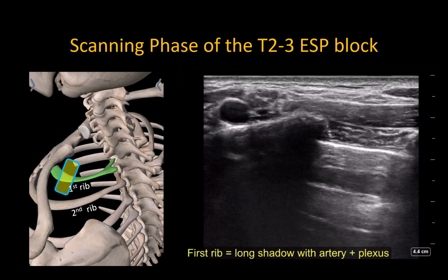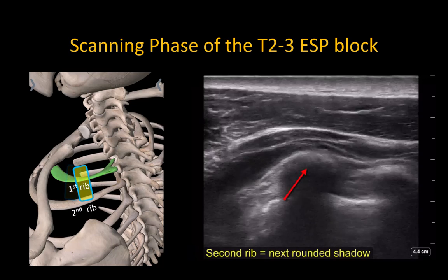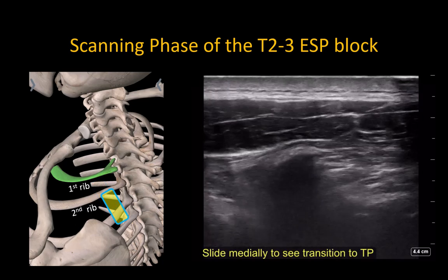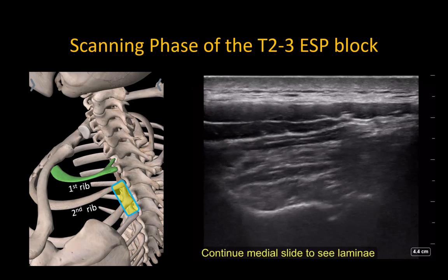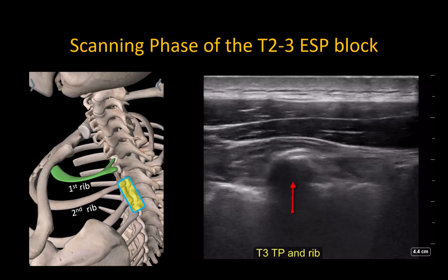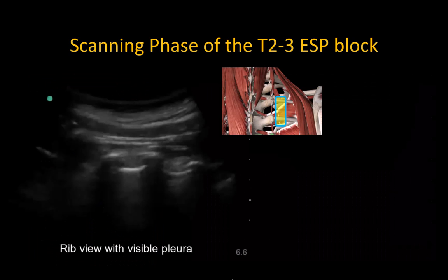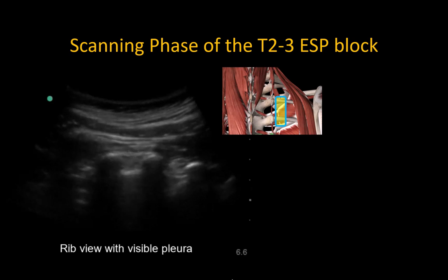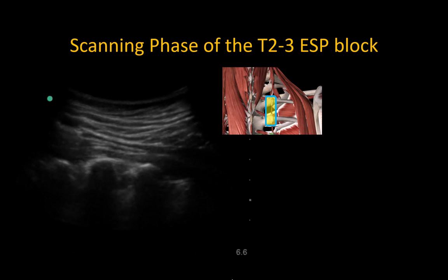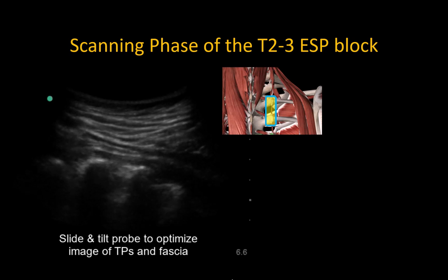Alternatively, we can start with the probe in the supraclavicular fossa to identify the first rib, and then slide and rotate it into a longitudinal parasagittal position over the trapezius muscle to count down to the second, third, and even fourth ribs. From here, slide the probe medially and watch for the transition to transverse processes. Sliding more medially, this changes to a view of the thoracic lamina, which have a characteristic flattened appearance. Slide the probe laterally to return to a transverse process view. In this example with a curved probe, we see the second, third, and fourth ribs. Sliding medially produces the transition to transverse processes; a view of the lamina indicates we have slid too far. Slide laterally back to the transverse processes and optimize the view with small tilting and sliding movements.